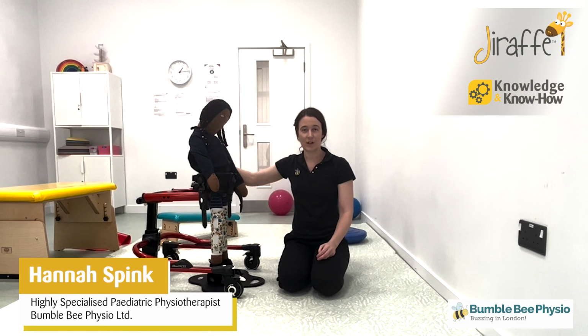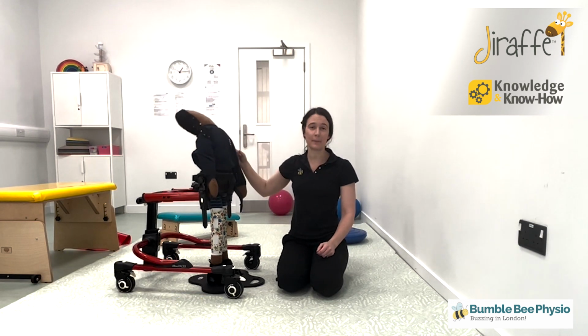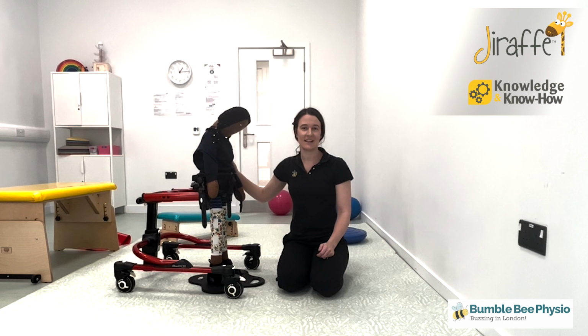The next active stretch I want to talk about with the Rifton Pacer is a hamstring stretch. Now, lots of the time, children have tight hamstrings. This could lead to a reduced popliteal angle, which might be just the very beginning factor, or it could be as much as a knee contracture.